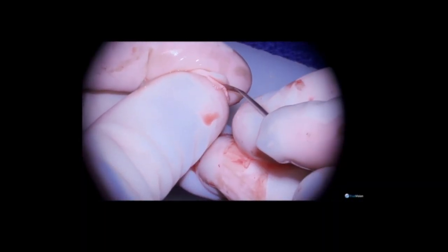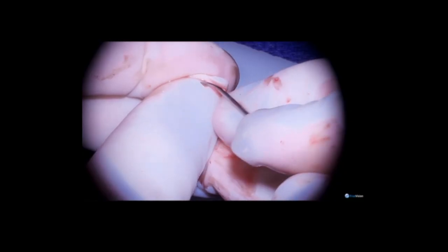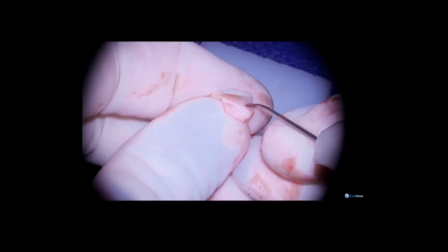For the reconstruction, I am going to use a combination of thin-cut tragal cartilage as well as an underlay graft of tragal perichondrium, which I am now separating from the harvested cartilage. It is important to keep this moist during the procedure, as if it is allowed to dry out, it can sometimes be very difficult to cleanly separate.